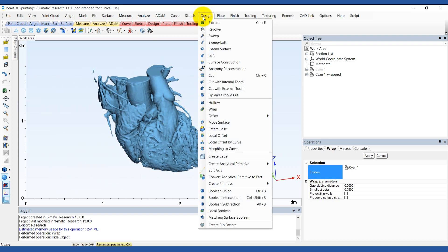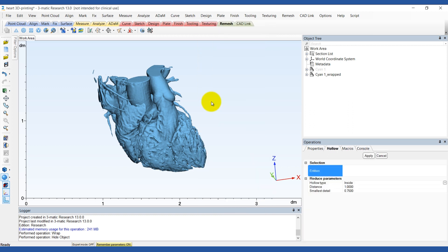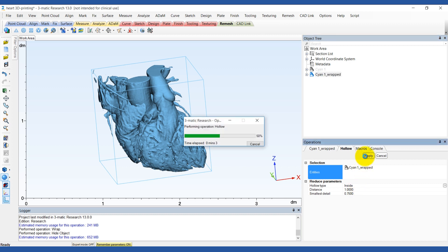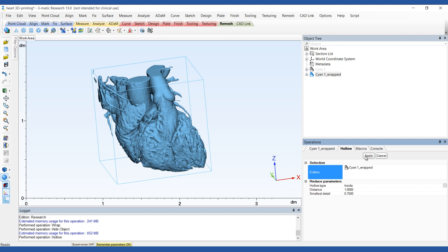If we want to create a hollow model of the heart, we can use the Hollow tool in the Design menu. Choose the wrap model as your entity. We're going to hollow it to the outside so that the outer surface becomes the inner surface of our hollow model. We can give it a uniform wall thickness. When choosing the thickness, keep in mind what printing technology you'll be using. If you're using a more flexible material, increase this value to around 2 mm, otherwise it's more likely to tear or rip. If you're using a more rigid material, you might be able to get away with a wall thickness of just 1 mm. In some situations, you might prefer to use the actual myocardial thickness around the ventricles rather than a uniform wall thickness — there's another video that goes through that process.